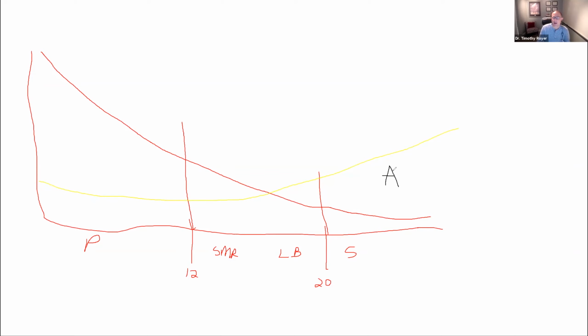The higher that high beta gets, the marker that we're going to say is when we start to get greater than 2.0 of the high beta ratio, we now know that these high frequencies are getting twice as high as they should be, indicating some type of problem in too much elevation of this high beta frequency, okay? And that's going to be representative of anxiety.